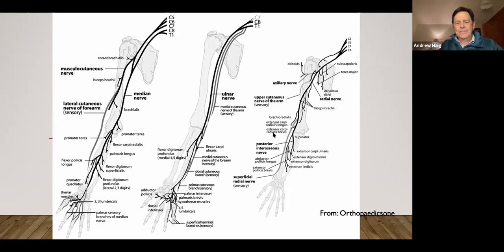So you can measure both on the thumb, right? Weird in the radial nerve, the brachioradialis is C5-6 innervated, go figure, right? So you're thinking radial, everything's abnormal, then you poke the brachioradialis and it's normal. And you're like, whoa, that's kind of weird, right? Or you're thinking cervical radiculopathy and you test the biceps and the deltoid. Not so clear. You check the brachioradialis, it lights up and the rest of the radial nerve doesn't, okay?